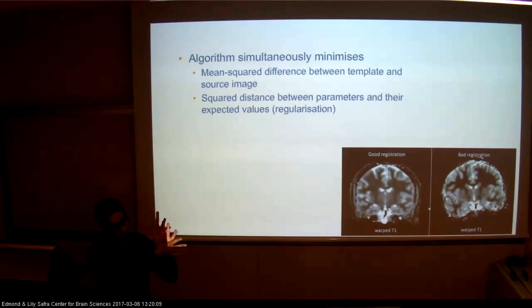Okay, so now I'm going to write a minimization problem, which when I do one minus the other, I'm going to get the minimum value in each position. So I'm going to look for the 6 parameters that give me motion, translation, and rotation that will minimize the difference between the 2 images. So that's my minimization problem.